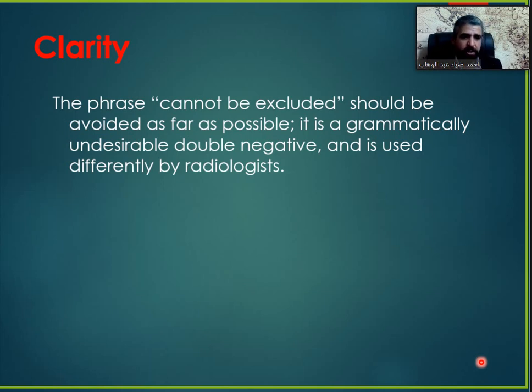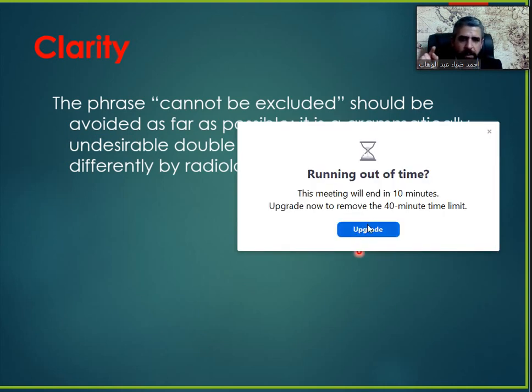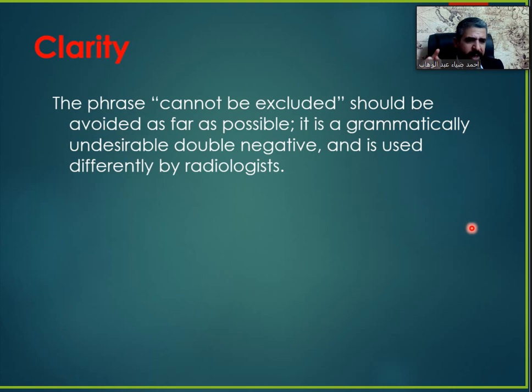When the diagnosis is mentioned but considered unlikely, other options are to state X is a remote possibility or consideration. For example, you write a cyst or a mass seen in the lung, carcinoma is a remote possibility or consideration. Okay? You don't write carcinoma cannot be excluded. Avoid the phrase cannot be excluded. Either it's likely, or it's more in favor of carcinoma, or it's unlikely. Don't use the phrase cannot be excluded. It's very unclear.